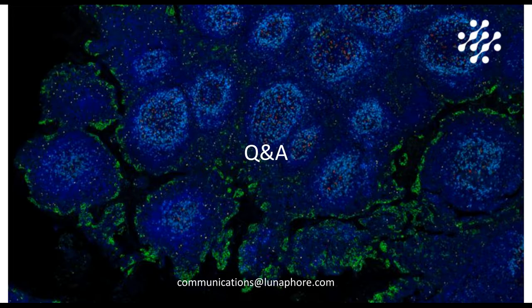So I would say you could follow the same approach that we had for lung, in the sense that you would need to first see how our standard protocol behaves on your particular sample, and then establish in what way you could tweak the initial standard protocol to make it fit your brain tissue.